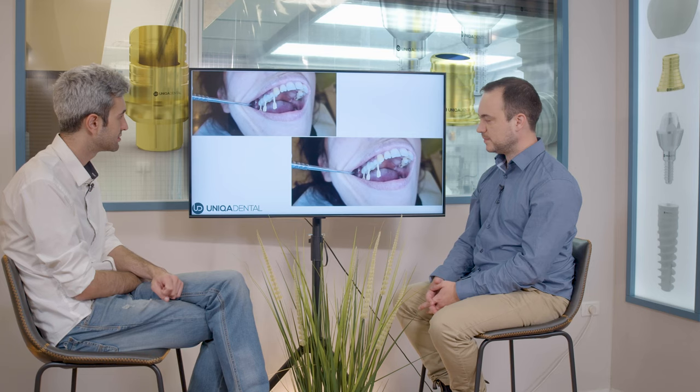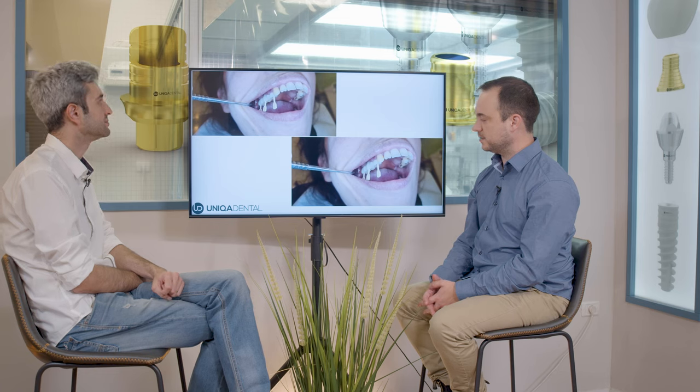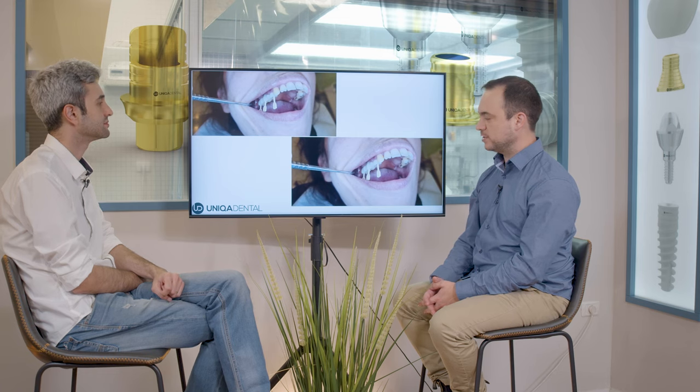In many cases it will just reject and you'll stay with two implants. This is the PMMA bridge. We have plastic pins that close the holes, and the bridge has as much material as possible to be strong. On this bridge, the two premolars were made a little bit smaller because we don't want more forces applied on the newly added implant.